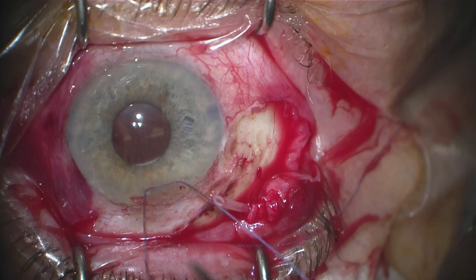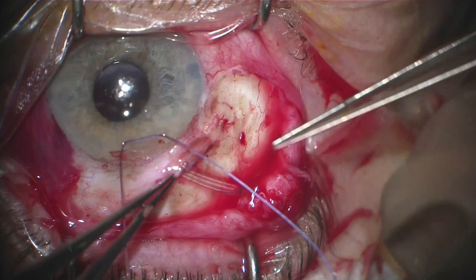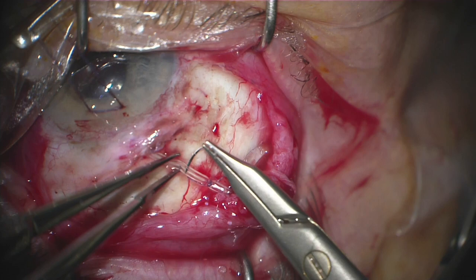We're now going to trim the tube with a sharp Westcott scissor. We want to be careful to make sure that the tube is not too short. We bend a 23-gauge needle, make a tunnel track into the eye, and then insert the tube. Ideally the tube is about two millimeters in the anterior chamber. We want to make sure it's parallel to the iris plane and far away from the corneal endothelium.